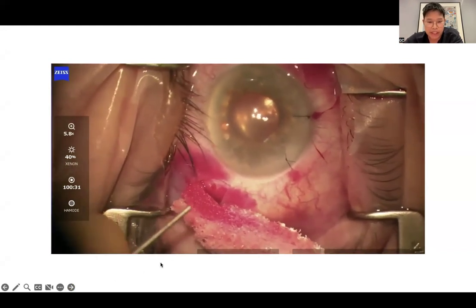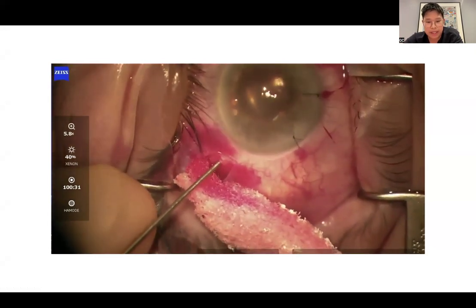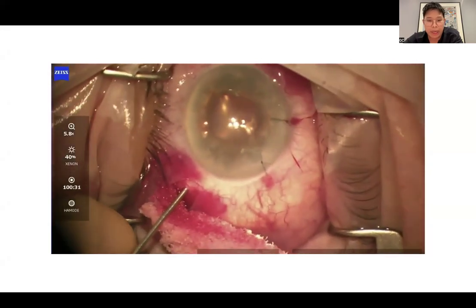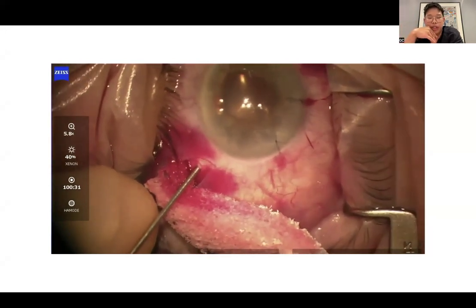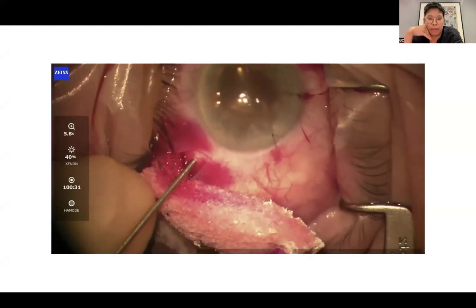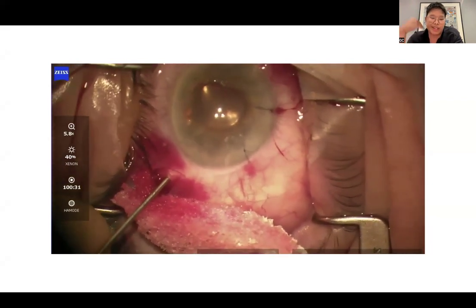The other option is doing a vitreous tap. But here you can see the vitrector foot down going through the pars plana, reaching out underneath that intraocular lens. What you're doing is just breaking up that anterior hyaloid so that the fluid can equalize with the vitreous. So here's my foot down. You can see the vitreous cutter behind the intraocular lens. And it's a safe technique.